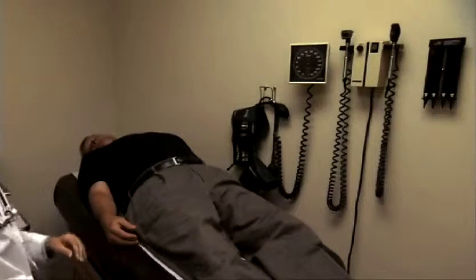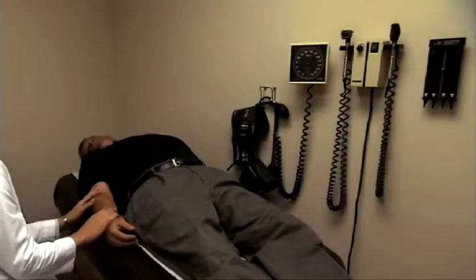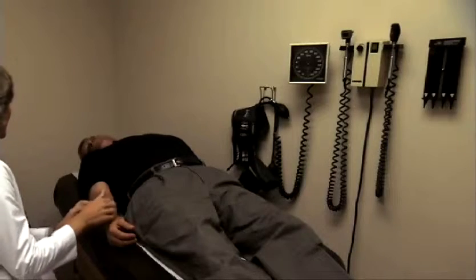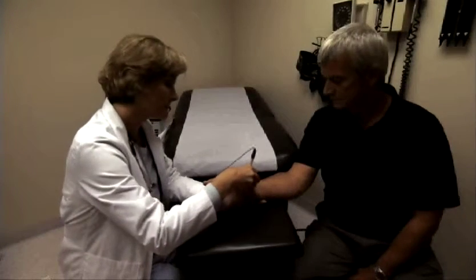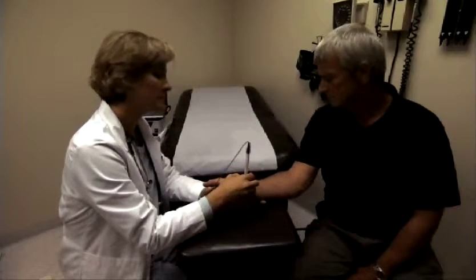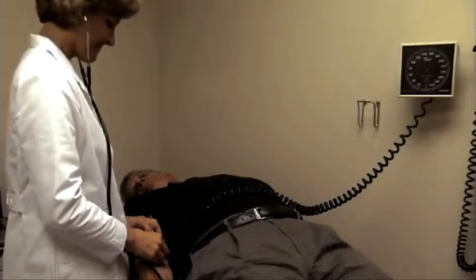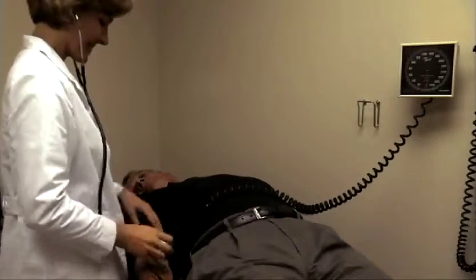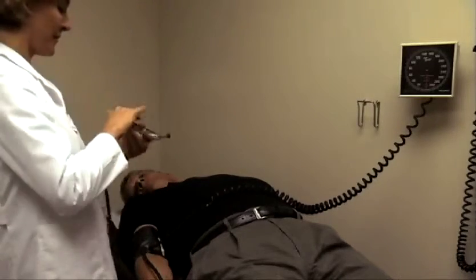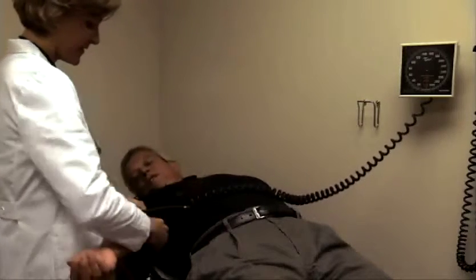Before performing a pulse wave analysis, make sure that you and your subject are in comfortable positions and that the surface that you use to support the subject's arm is completely stable. Depending on the individual study protocol requirements, assessments may either be performed with the patient seated or supine. The patient should be in the same position for brachial blood pressure and sphygmocore testing. Review the study protocol to determine which arm should be used for brachial blood pressure measurement and pulse wave analysis.